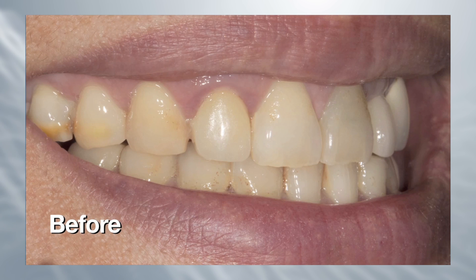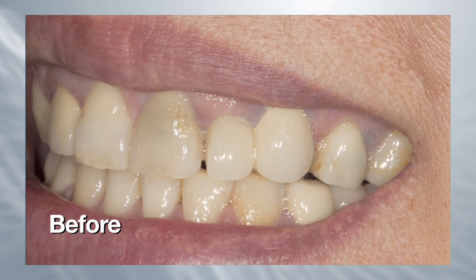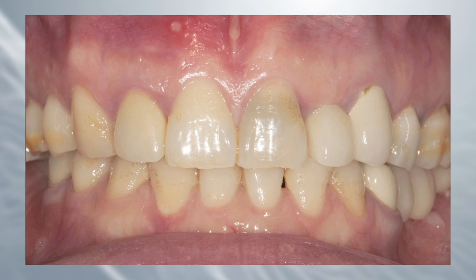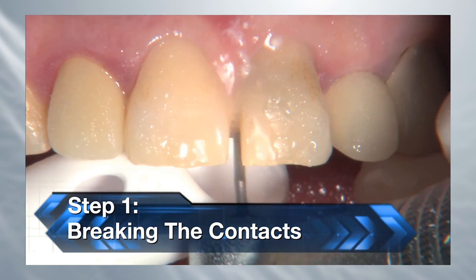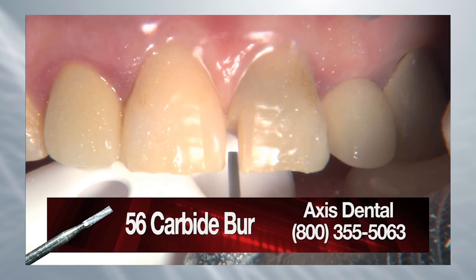For this case we're going to prep tooth number nine using this technique. It's an interesting case — tooth number seven has an all-ceramic crown, tooth number eight is a natural tooth, and teeth ten and eleven are splinted PFM. Tooth number nine is an endodontically treated tooth with some old failing composites. We're going to prep this for a crown. Step one of the reverse preparation technique, like most other crown prep techniques, is to break the contacts using a 56 bur to create space between the prep tooth and the adjacent tooth.